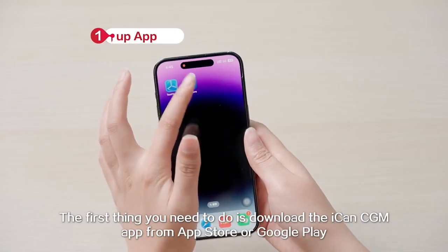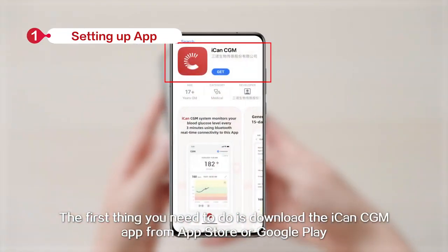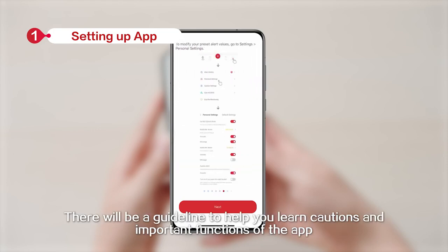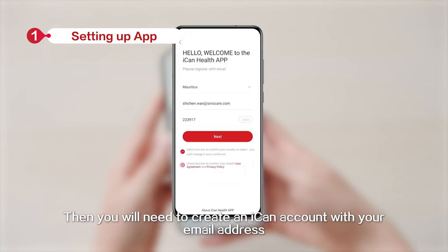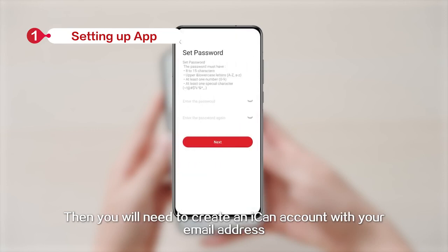The first thing you need to do is download the iCan CGM app from the App Store or Google Play. When you download the app for the first time, there will be a guideline to help you learn cautions and important functions of the app. Then you will need to create an iCan account with your email address.